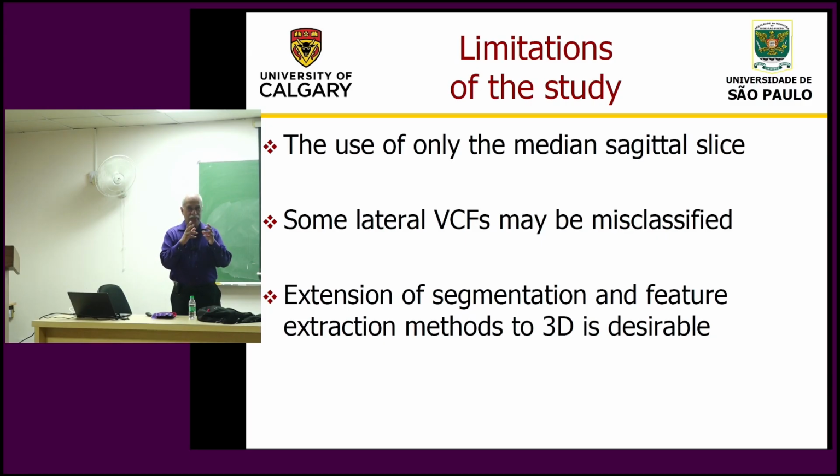So the observations of the radiologist, based upon which we have noted all these properties and developed these methods, those observations have been made in 2D. So we think that maybe there is something more in 3D, but that was not the case. And even in the case of lung tumors, some features were extracted in 2D and 3D, and there wasn't much of an advantage.